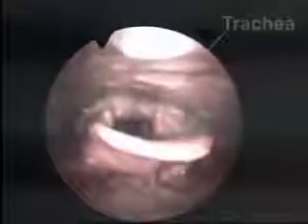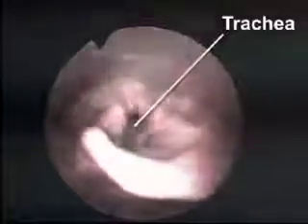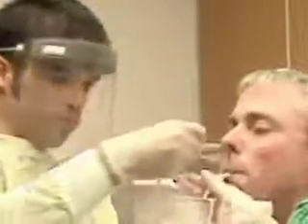This is a fluoroscopic view of a nasogastric tube being inserted. As the tube reaches the level of the larynx, advancement is temporarily halted. The tube is then inserted as the patient swallows, and, once past the larynx, is rapidly advanced. Note that in this endoscopic view of the larynx, the trachea is frequently open and may be accidentally intubated with an NG tube. Note also that as the patient swallows, the laryngeal apparatus rises and the epiglottis covers the glottis, preventing tracheal entry. Once past the larynx, the tube may be inserted rapidly to the predetermined depth.